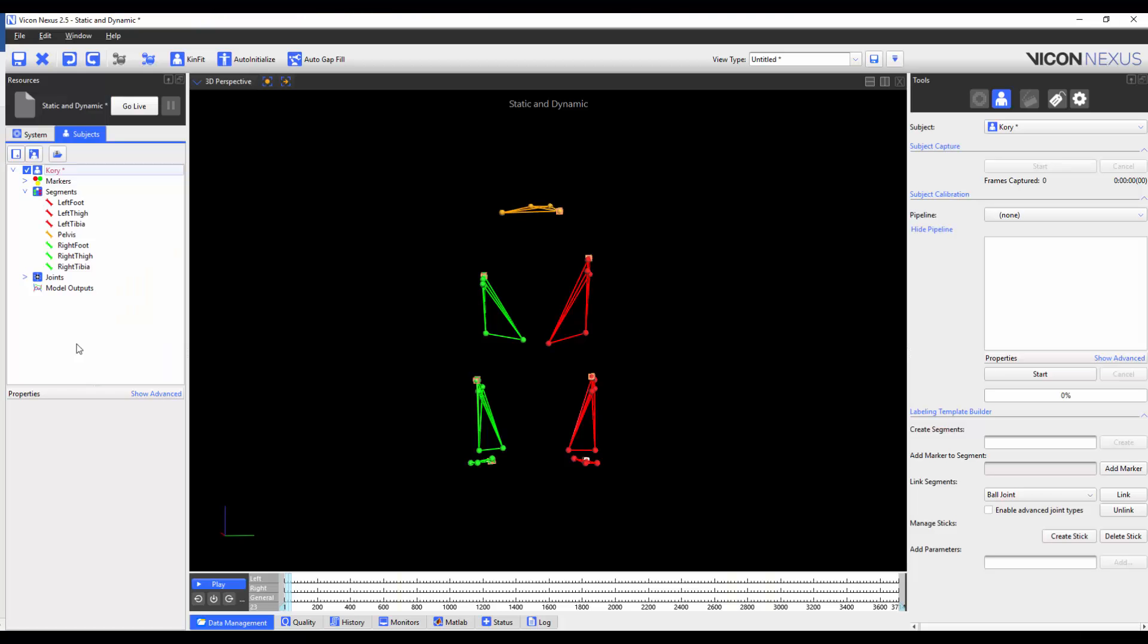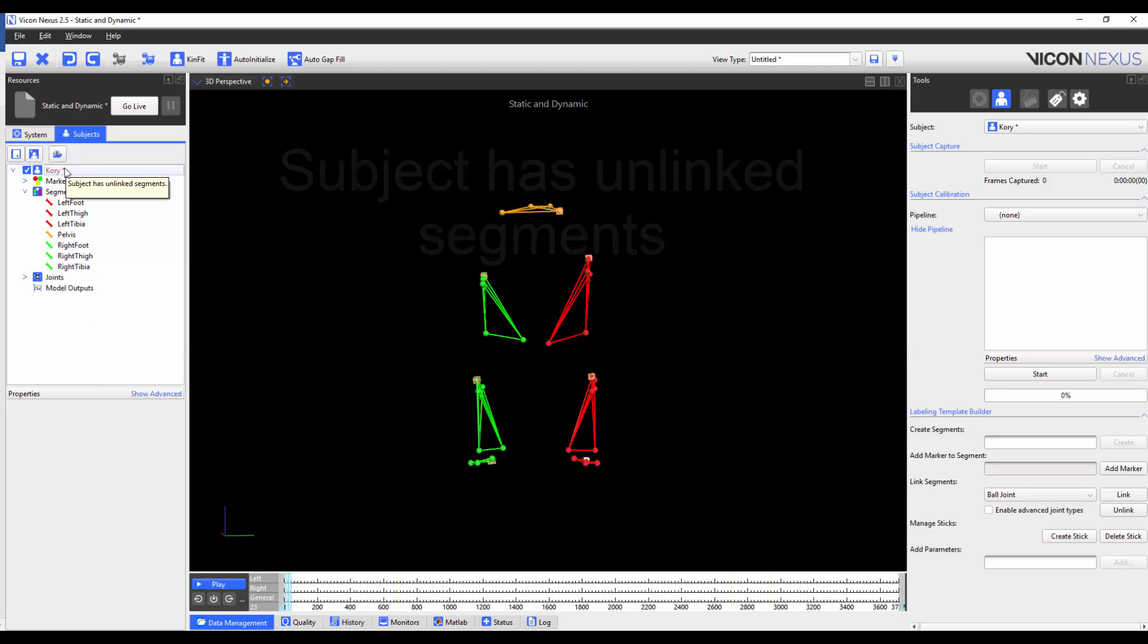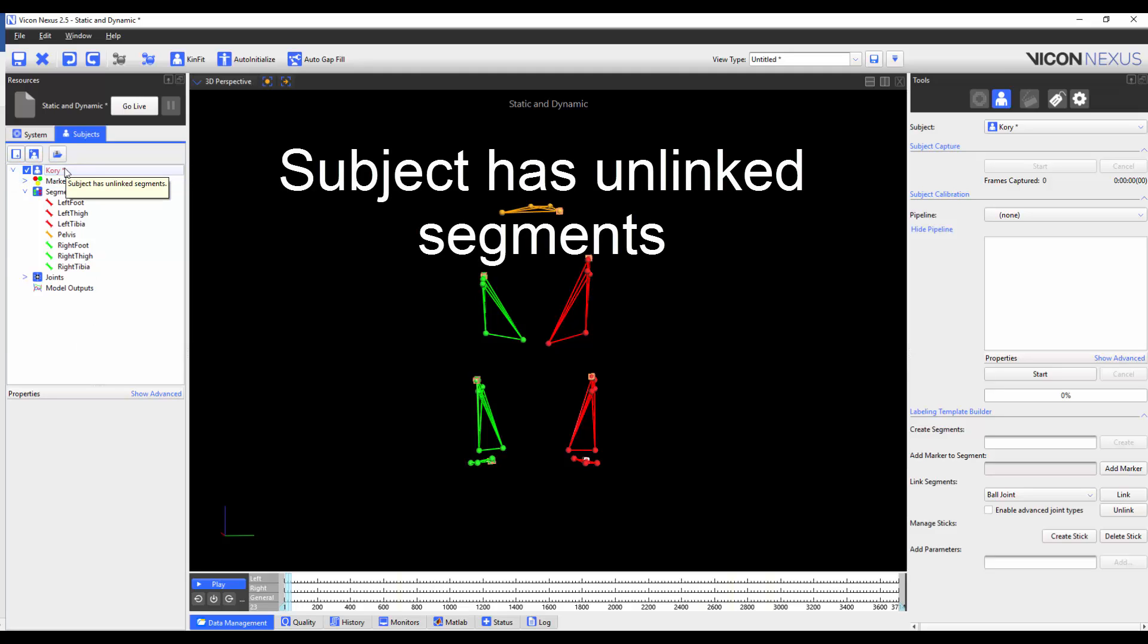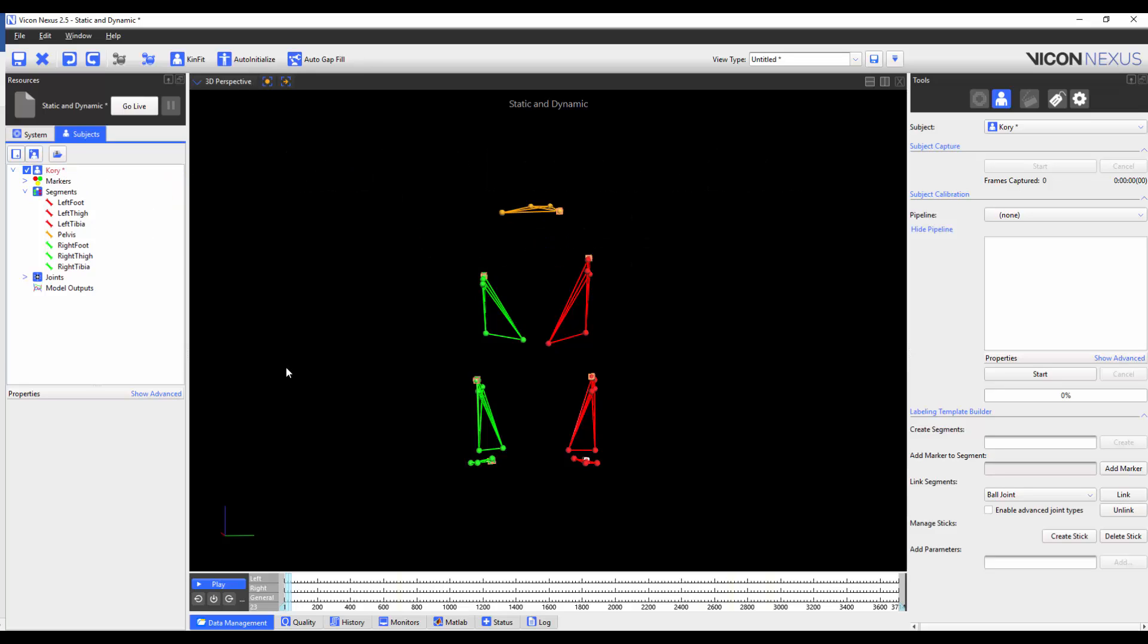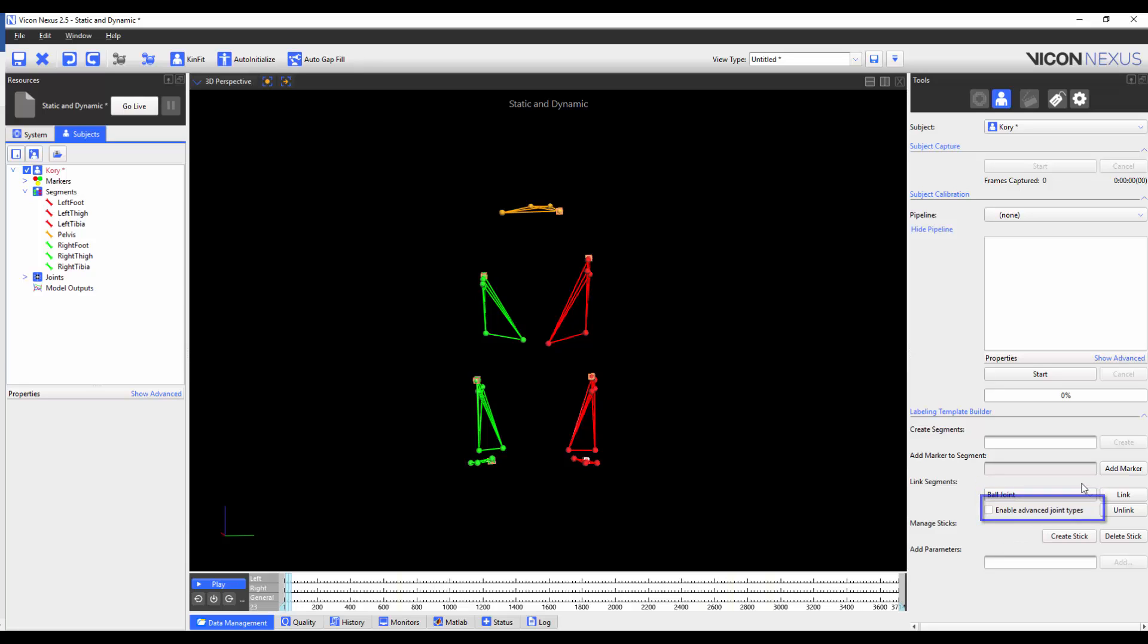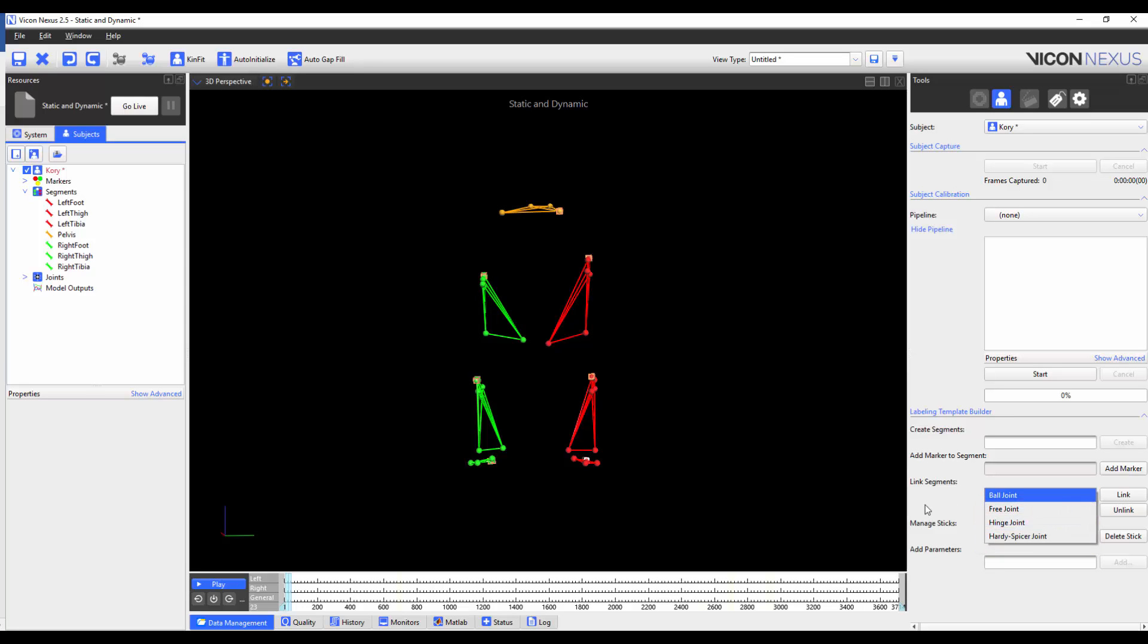Although we have finished creating our segments, the subject name is still in red. Hovering our mouse over the top tells us that the subject has unlinked segments. We have the option of linking the segments either using a ball joint, a free joint, or if we check enable advanced joint types, a hinge joint, or a hardy spicer joint. In this example, I'm going to use a ball joint for all joints. I've chosen to use a ball joint as opposed to a free joint because my segments are physically adjacent to each other. The hardy spicer and hinge joints are beyond the scope of this video.